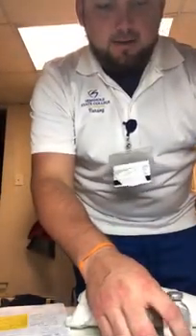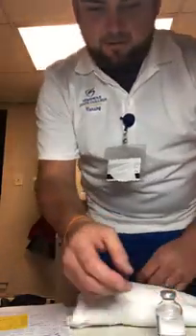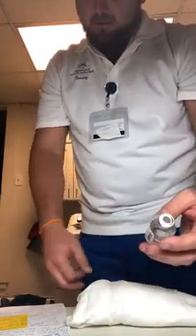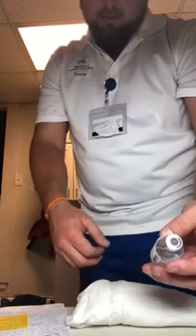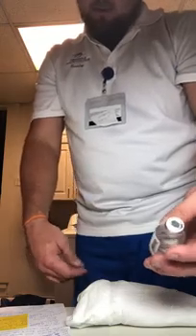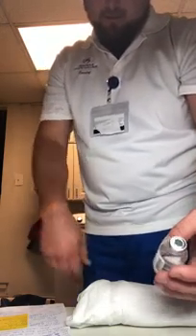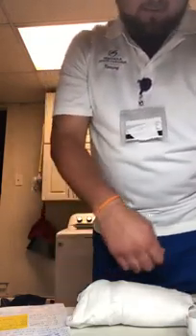So I have the influenza vial, and I'm going to do my 6 R's again to make sure. We've got Anna Pawlowski, 5/5/57. She has orders here for a 0.5 milliliter intramuscular injection to be given at 14:58, and we're going to be documenting this as soon as it is given, and we're going to go ahead and fill that up.